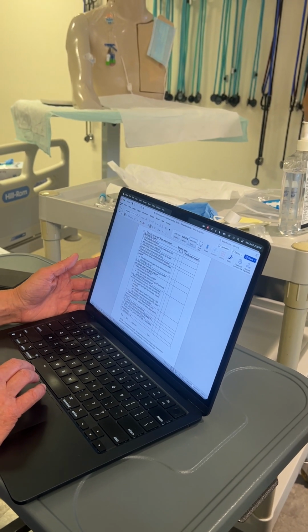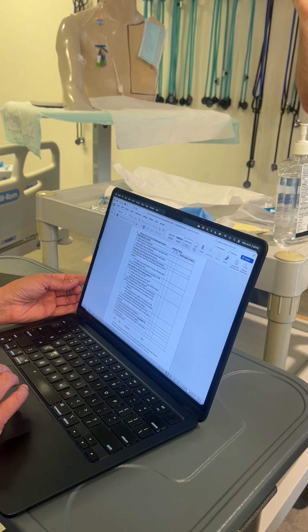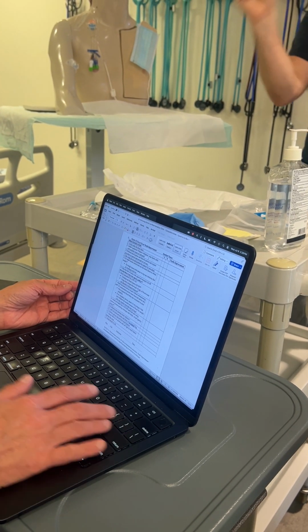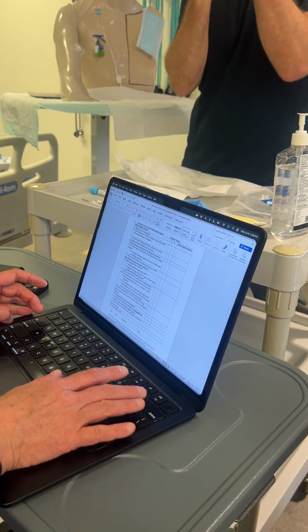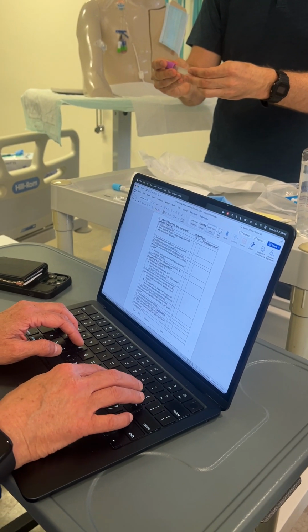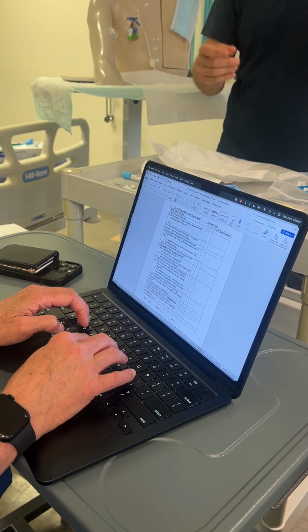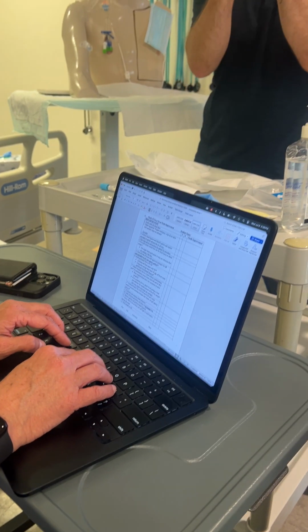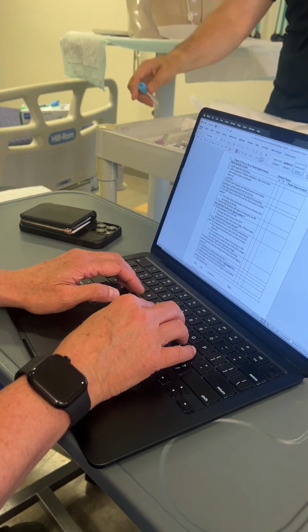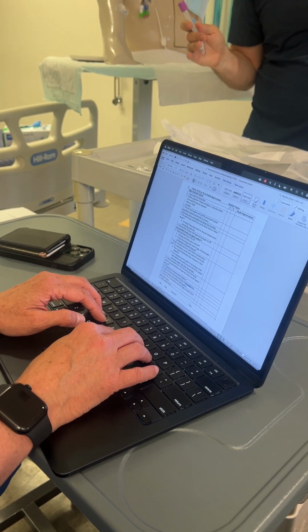Yeah. So what I want you guys to remember is that in each tube, most tubes have an agent in them, right? So if you look at the tube itself, it'll say on here, vacuum container, the EDTA, right? It'll tell you the stuff that's in here. And if you look, there's the powdery stuff in here, right? So just be cognizant these different tubes, they're for different labs, different purposes.